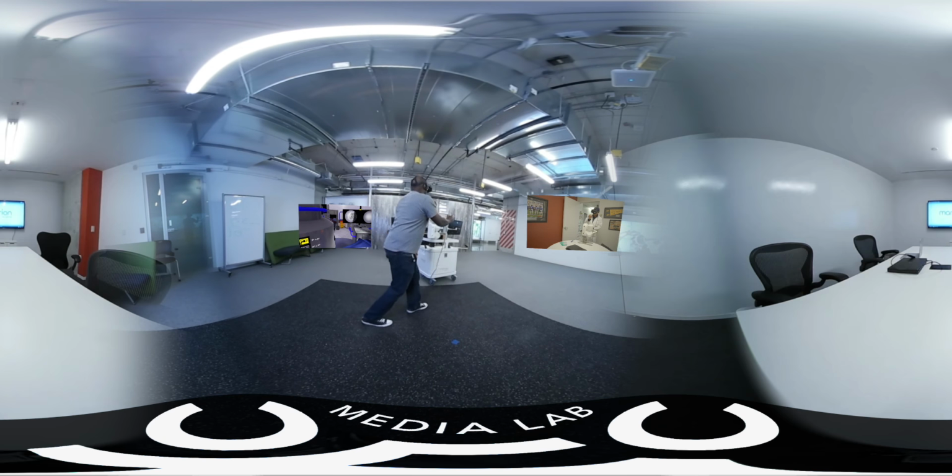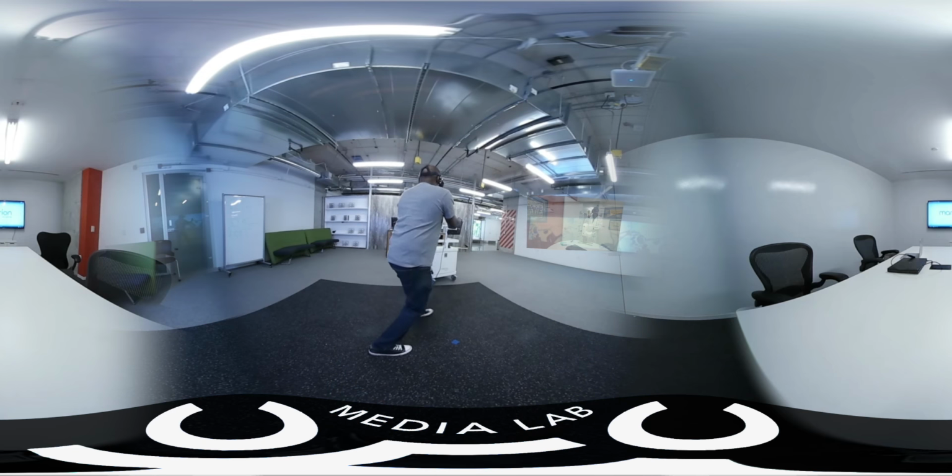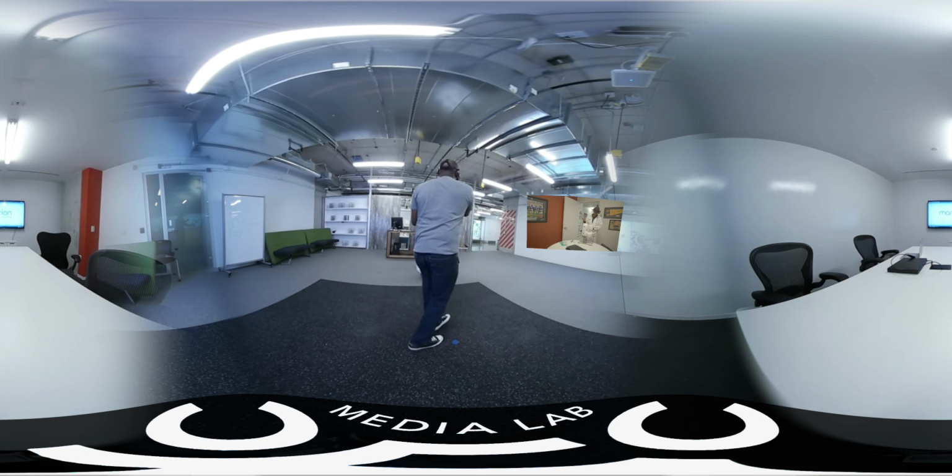I've got a wire in place now, and that will allow me to take a dilating balloon as my next step. That will allow me then to put a sheath in, and through that we'll put our scope in and then break the stone, and away we go. So that's really how we do it.